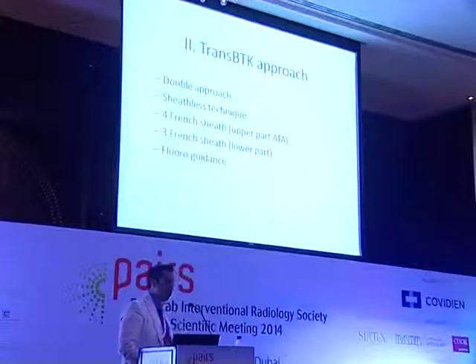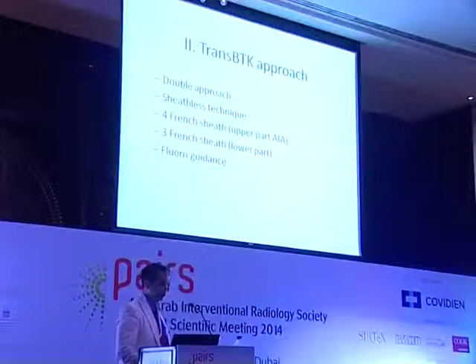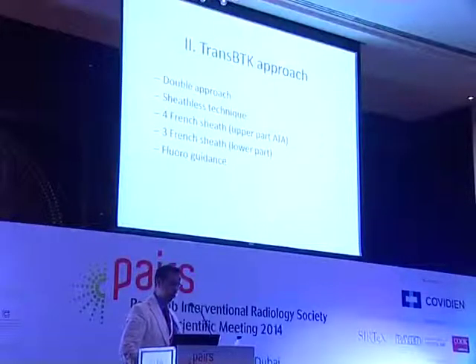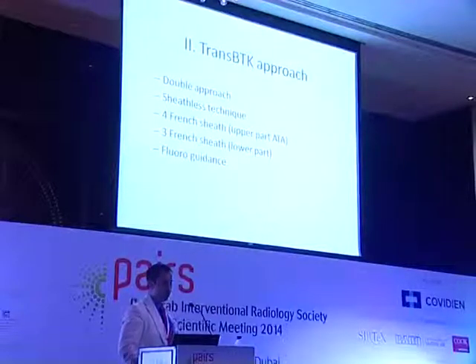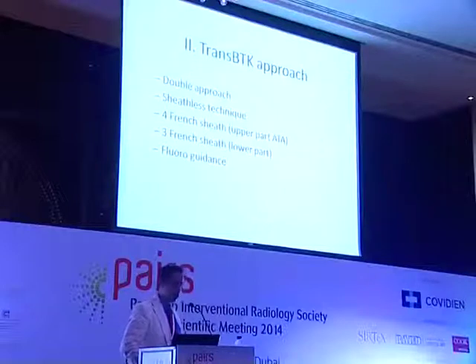What about the below the knee approach? It's also a double approach, sheathless technique or 4 French, and now we can also have the 3 French sheath if we puncture at the lower part of the limb. And we prefer to have fluoroscopic guidance more than ultrasound because it is the easiest way, and preparing the ultrasound material is time consuming.